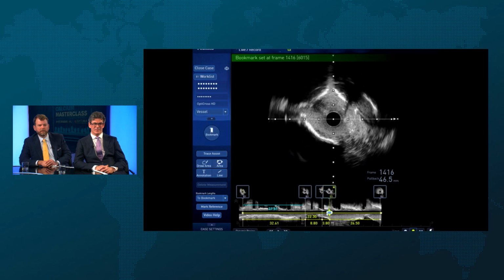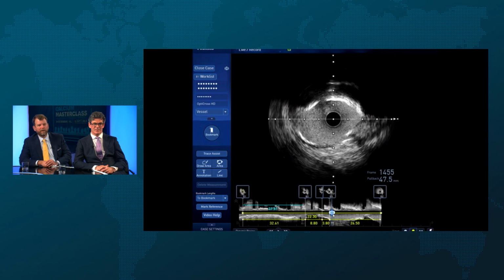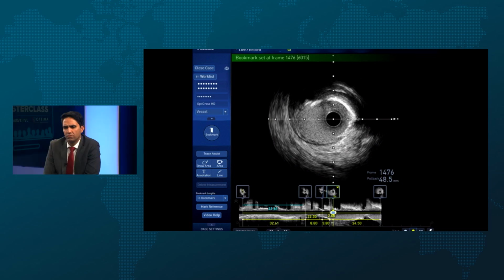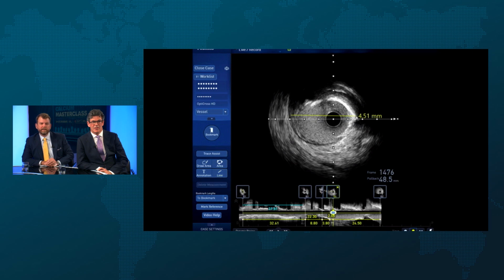So I think we probably don't want to overlap at that kind of aneurysmal area. Would everybody agree with that? Right, you don't want to get into it. We can probably get across it with a 40 if we wanted to do that. But I think if you take a guide extension, 3.0, pretty far, you should be able to get that. What size is 48, approximately? That's the only thing that I wanted to make sure, that we were able to get that stent size up appropriately. So we'd need a 3.0 that went to 4 or 5.